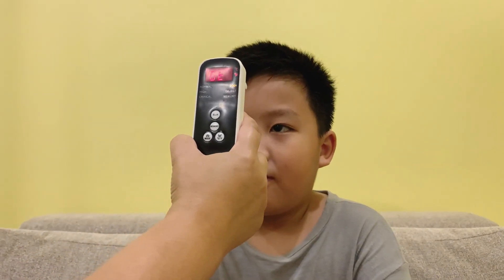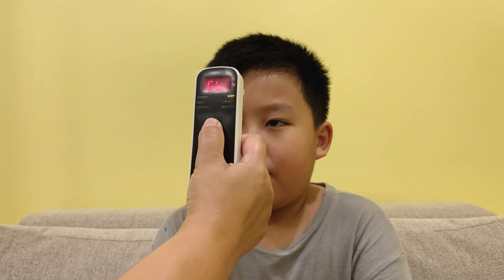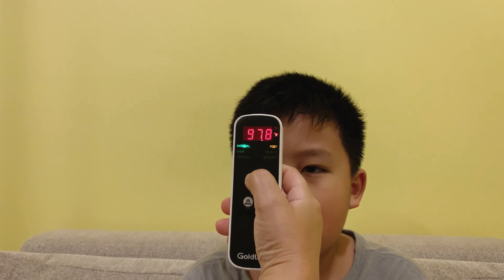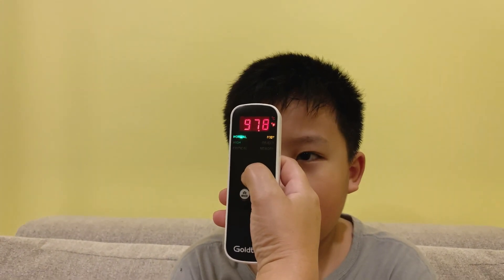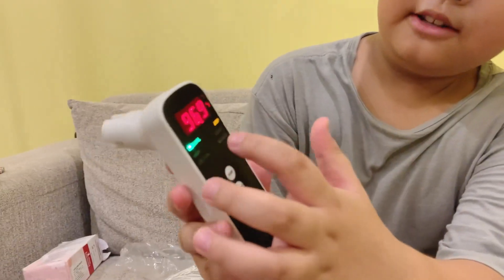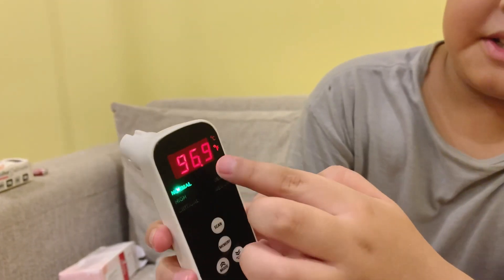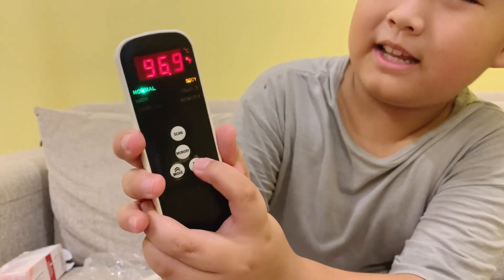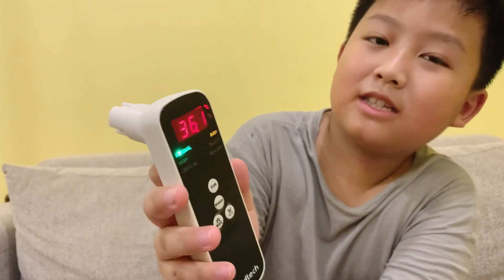Mom, can you scan my temperature? Okay, so it's 97.8 Fahrenheit — that's a normal body temperature, that's good. As you can see, it can scan the body and an object, and there's also a normal, high, and critical indicator. To change it to Celsius, press this Celsius button — so 36.1 Celsius.